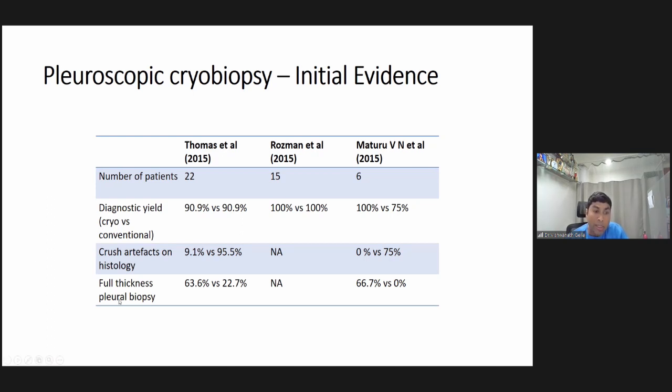So it was also seen that when the cryoprobe biopsy was used, the full thickness pleural biopsy was obtained in more patients compared to the forceps biopsy. However, both studies have shown that the diagnostic yield was similar, cryo versus the conventional forceps biopsy.